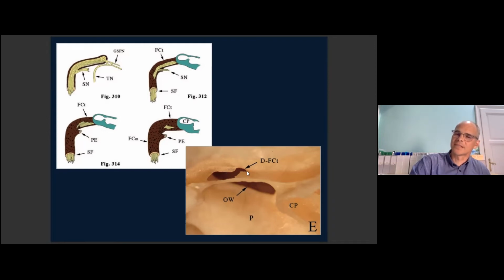This is a dehiscence. So if we have a patient with otosclerosis in this area, focal otosclerosis, we remove the crura and we will prepare here with a hook through this hole, which you can't see because this is outside the view of the surgeon. By turning the hook cranially, you can damage the facial nerve through this dehiscence. Be careful.